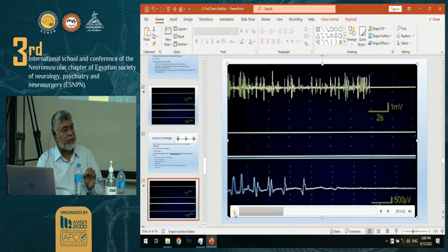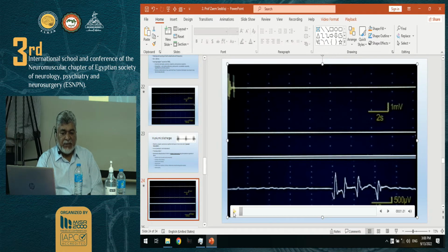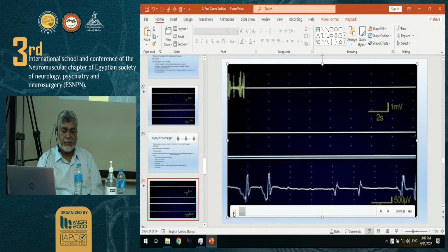Group motor units firing together, no pattern. They fire, this is not the best example, but if you think about soldiers marching, they fire just like a group of soldiers marching, it sounds like, but they are group discharges, and again seen in certain conditions. I'll go there in a second.